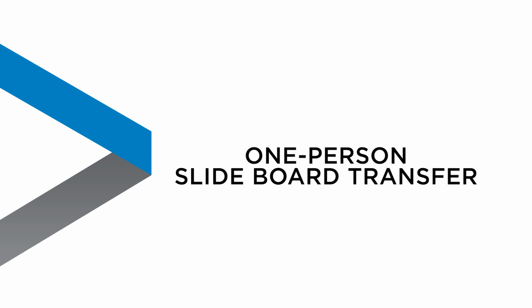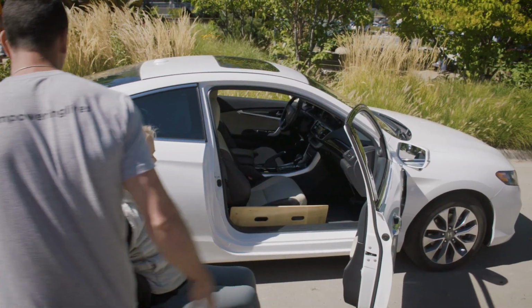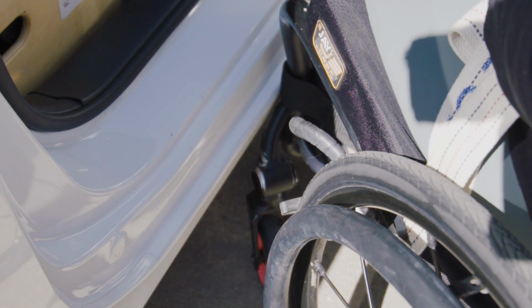Generally, when only one person assists in a transfer, the assistant will provide help from outside the vehicle. Set the wheelchair at an approximate 30-degree angle. The front of the big wheel must be even with the door frame. Lock the brakes and ensure the casters are set forward.